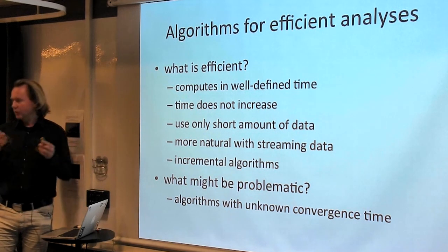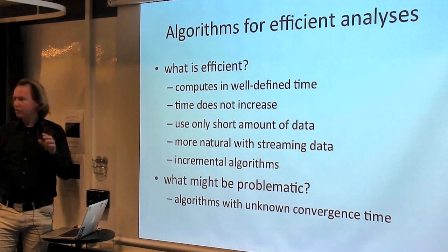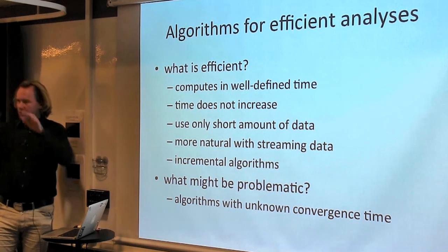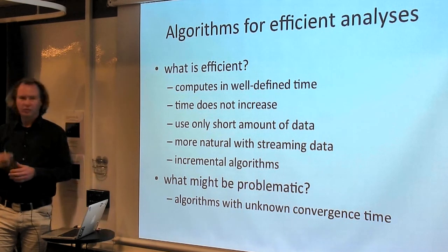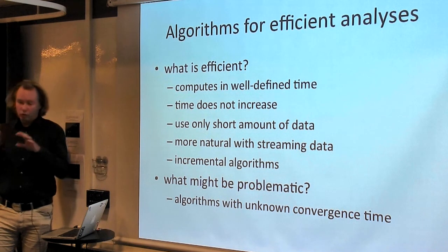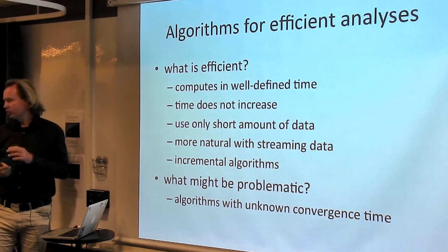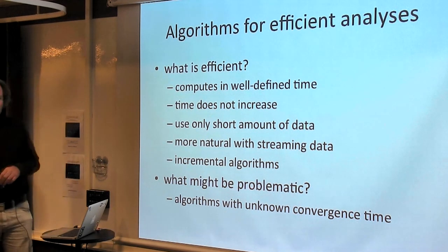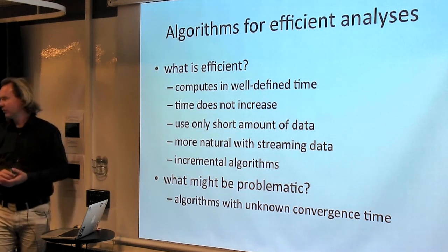One of the things that we're doing in real time is head localization. The MEG uses these head localizer coils, which are magnetic dipoles. We measure the helmet topography, and we can do a real-time dipole fit for each of the magnetic dipoles. That works quite robustly. The only problem is that this nonlinear optimization procedure, which will be explained tomorrow, has an unknown time in which it converges. So there's no guarantee that it can be done in real time.